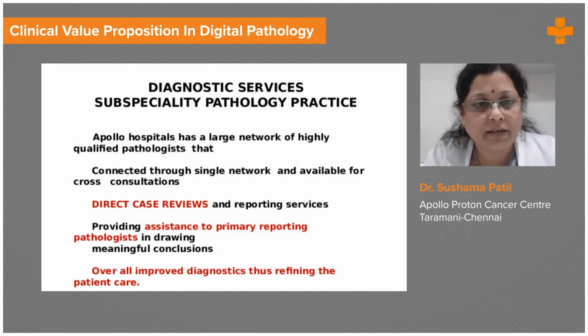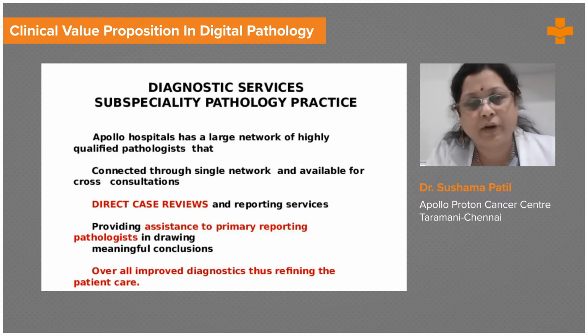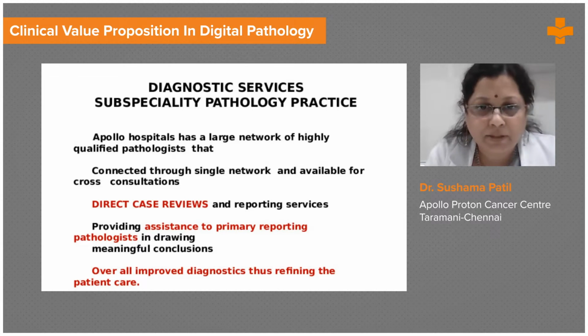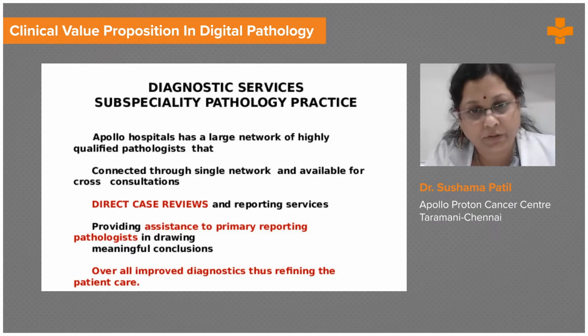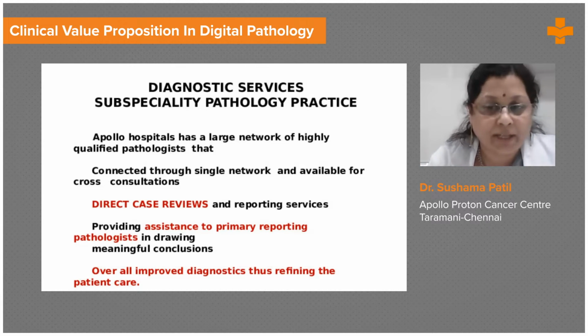So I, sitting in Chennai, can send a case to Hyderabad to review for Swarna madam, who is a nephropathologist. If I have a case, I can share it with her, or I can tell her to take over the case, please. It's difficult for me, can you sign out the case? So these requests in the arena of patient care will be improved, and it also gets the deserving pathologists who can do justice to the case.